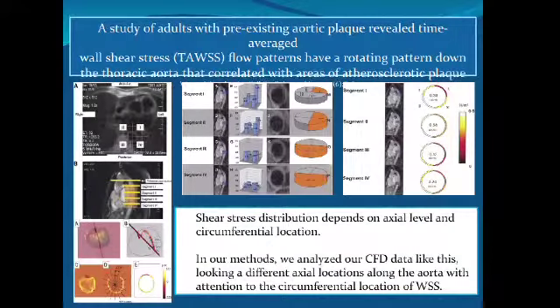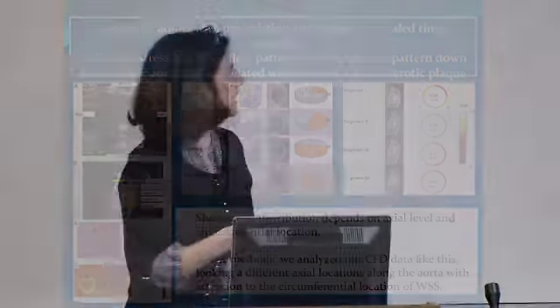So very, very important. And bloodborne cellular elements have a longer residence time, and so you actually can damage the vessel in that regard. So it's kind of a busy slide, but I wanted to walk you through it because it's one of the first adult studies looking at thoracic aortic plaque, and it has bearing on how we analyzed our data. So this is the aortic arch, and they looked at different levels along the aortic arch, different segments that they were going to image by MRI. They did an MRI image, and then they realized that different regions of the circumference may not actually be the same.